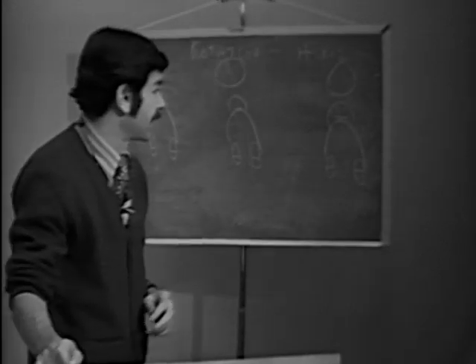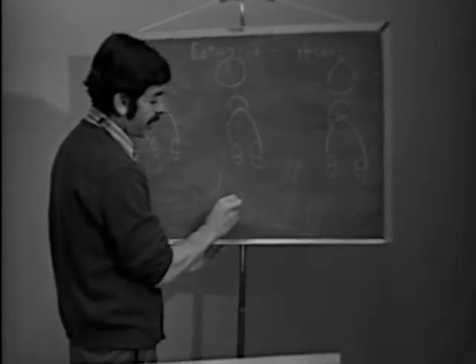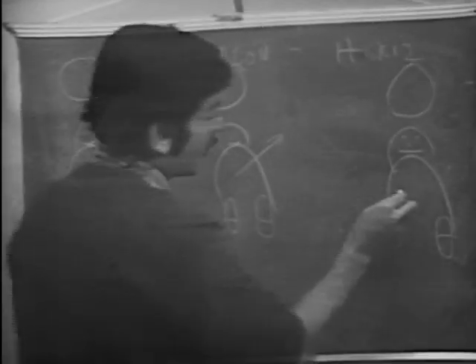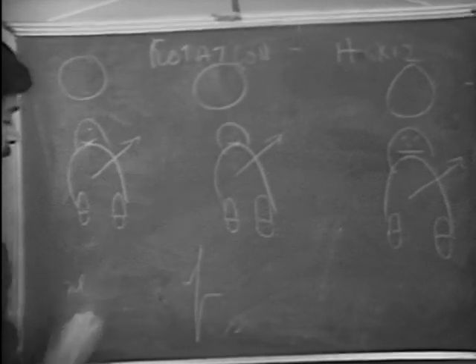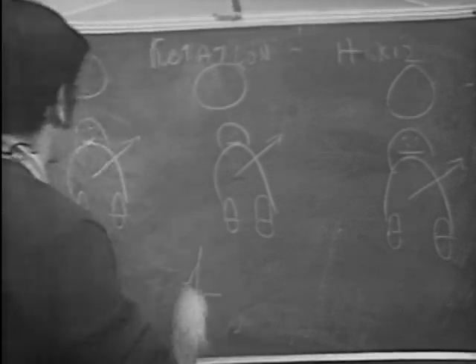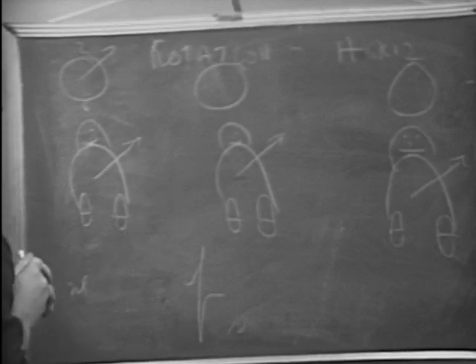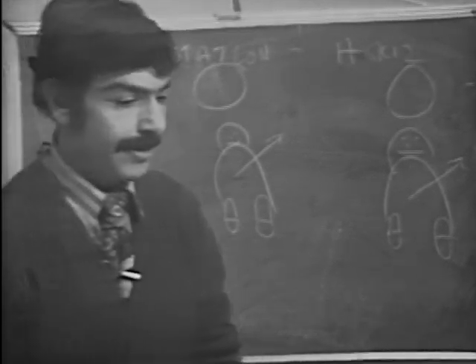V3 or V4 is normally the isoelectric lead. So by isoelectric, again, we mean equally up and down. So the isoelectric lead generally goes out about in this direction. Right, this is our normal patient, and this is what the isoelectric lead should look like. And here's our clock, 12 o'clock, 6 o'clock. So we're normally going at about, let's say, 1:30, let's say 2 o'clock, for the sake of argument.